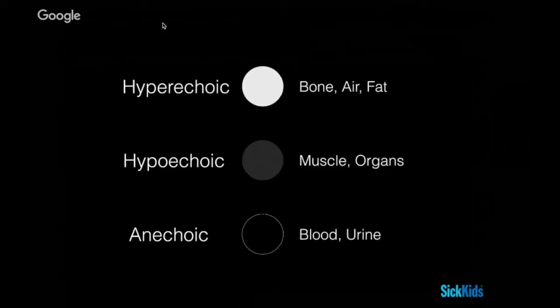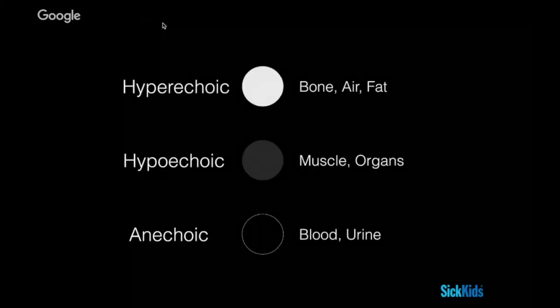One of the ways this physics translates into reality for imaging our patients: which organ do you think has more water content, the liver or the kidney? The kidney — it's your great filtration organ, filled with vessels everywhere to filter blood. So you'll get used to seeing in your right upper quadrant shots: here's my liver, here's my kidney — my kidney looks darker, my liver looks brighter. One day you're going to see a kidney that looks brighter than the liver and think something's wrong.